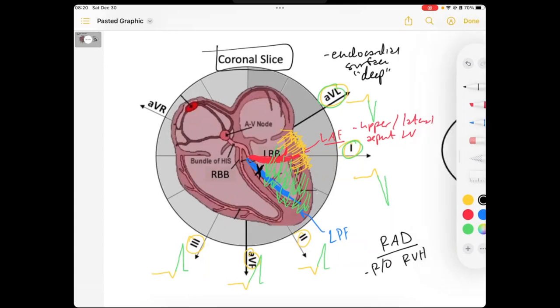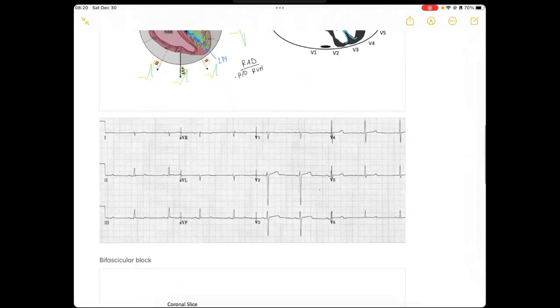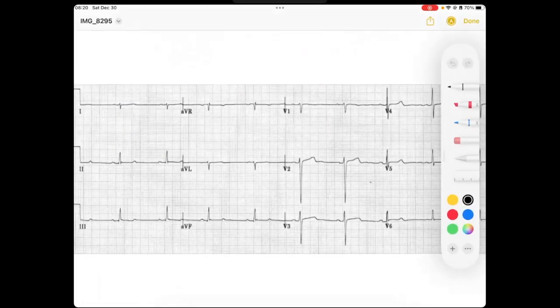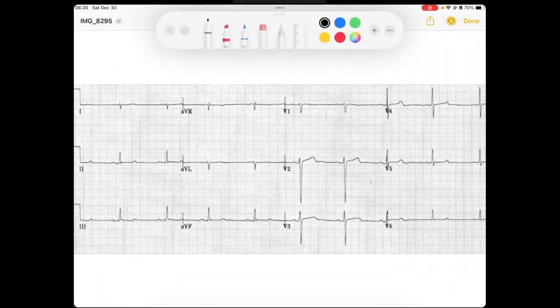All right. Let's take a look at an example. So here we've got a normal EKG. We look through. We see regular rhythm. We get P's for our QRSs. They're upright in 1, upright in AVF. So it's probably a sinus P wave. Got a normal PR interval.